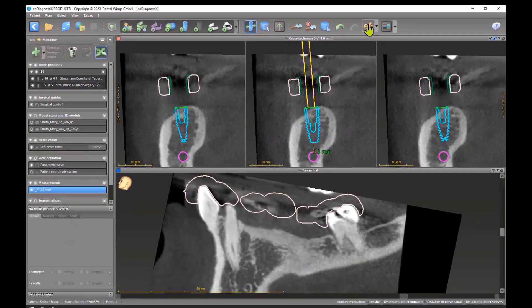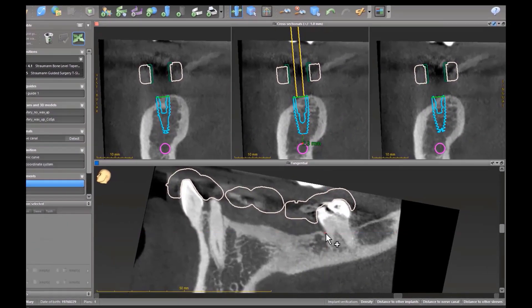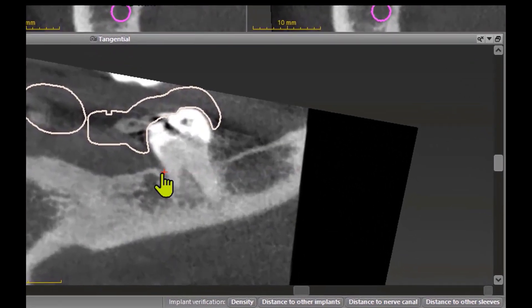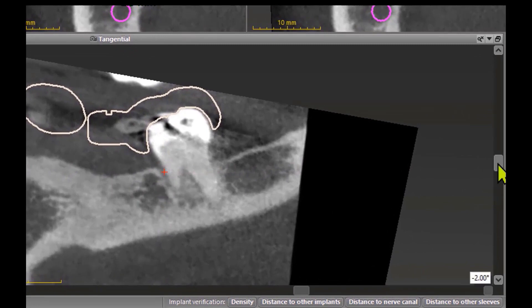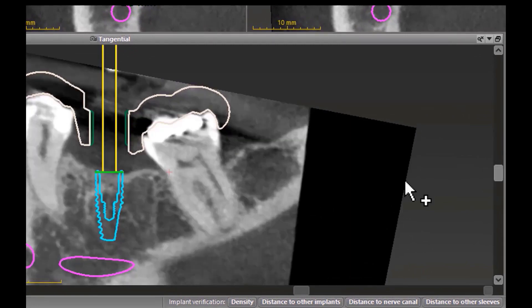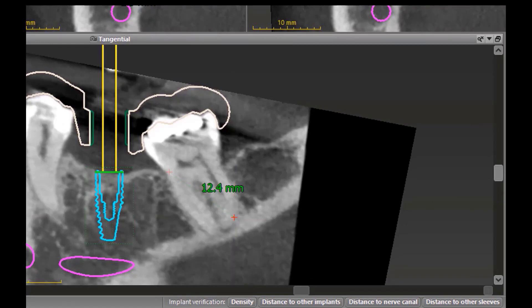Want to make an additional? Click again here, measure, and here in the moving picture of the tangential you can make a starting point and move to the other direction of the teeth, and then you have a three-dimensional measurement.